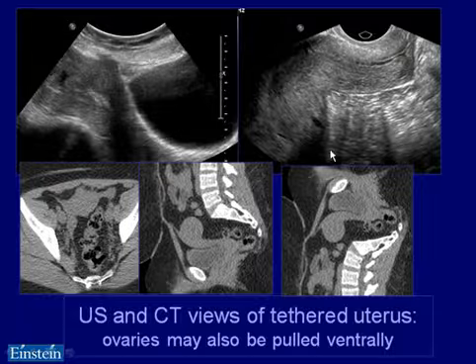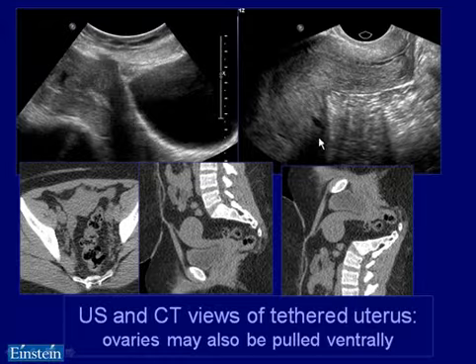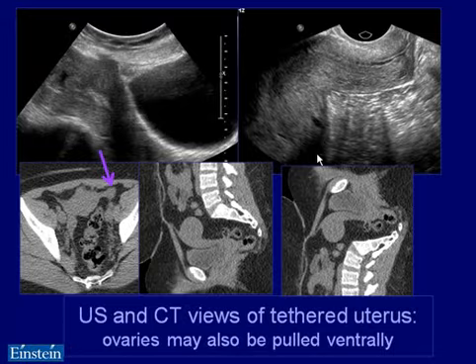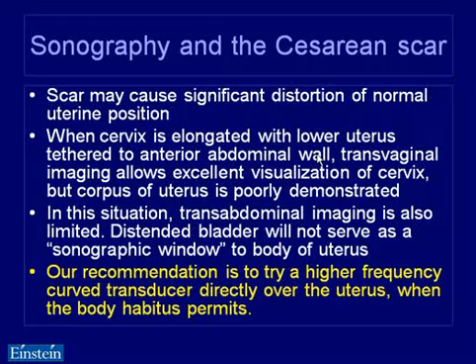Here's the cervix, and the body and fundus of the uterus are far from the transducer. Here they are here, and oftentimes we just cannot penetrate far enough with a transvaginal probe. So what to do? Well, it's a problem.